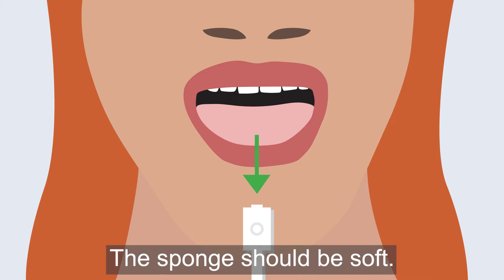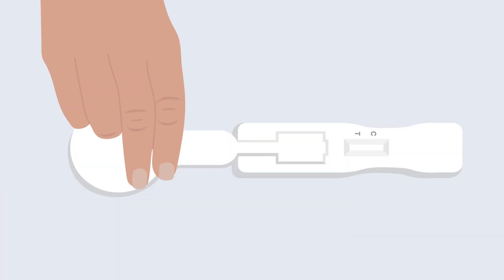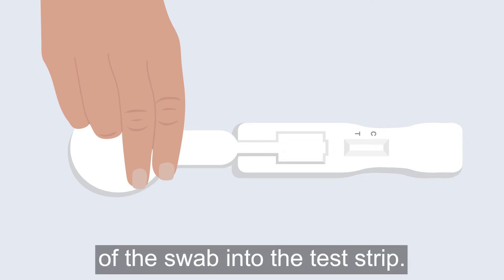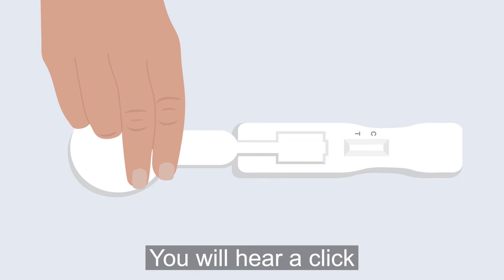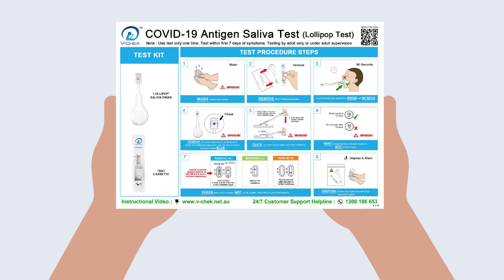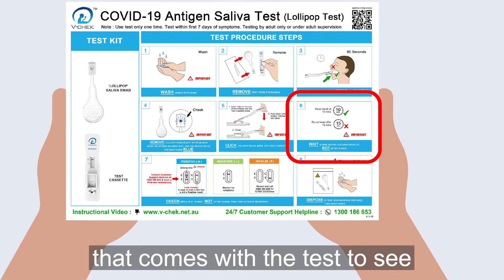Take the sponge out of your mouth. The sponge should be soft and the circle on the back should be blue. Put the sponge end of the swab into the test strip. You will hear a click when it is in the right place.